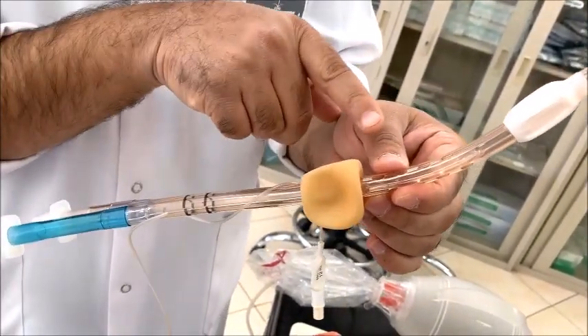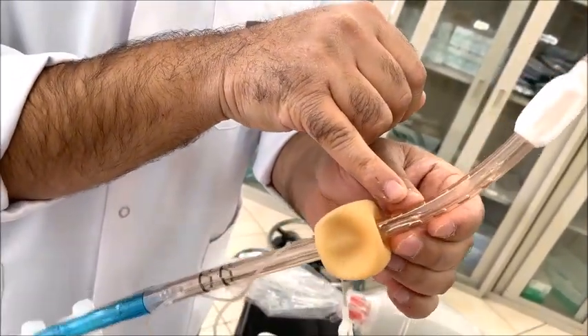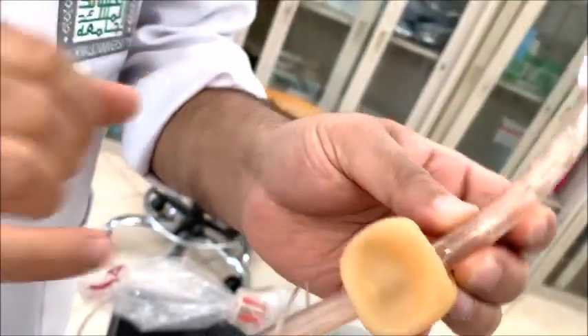As you can see, in between the distal and proximal cuffs, there are eight ventilatory ports: ports 1, 2, 3, 4, 5, 6, 7, and 8.